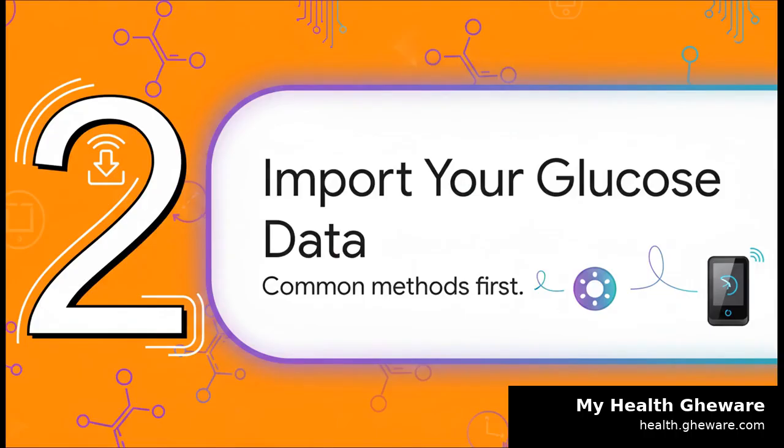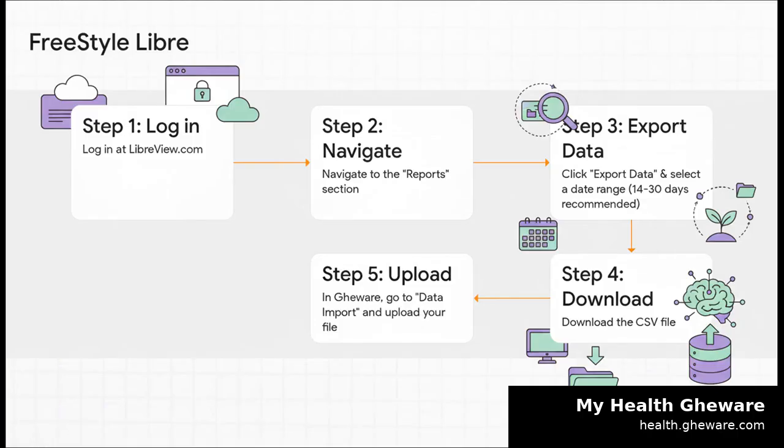See? Simple. All right, time for the main event. Let's get your data imported. We're going to kick things off with the two most popular systems out there first. Okay, Freestyle Libre users, this one's for you.